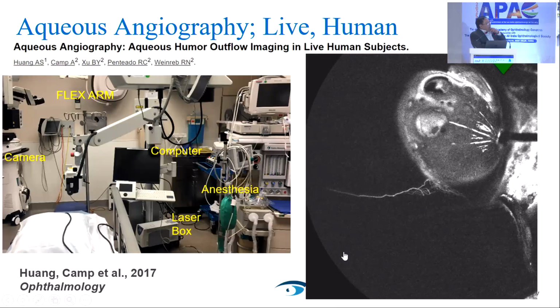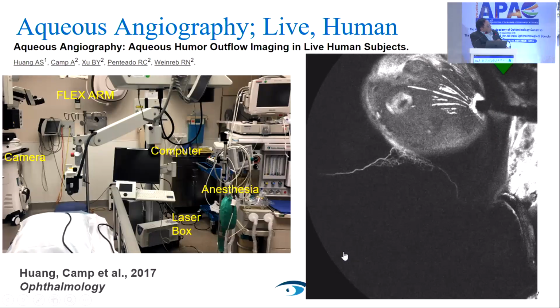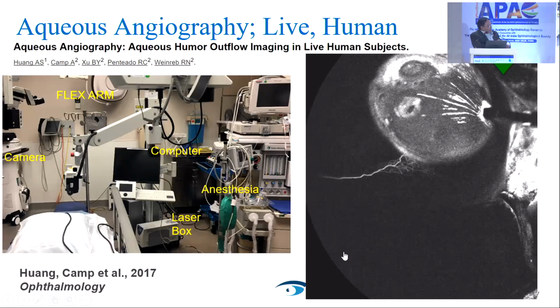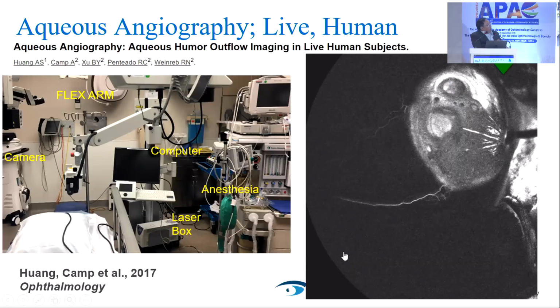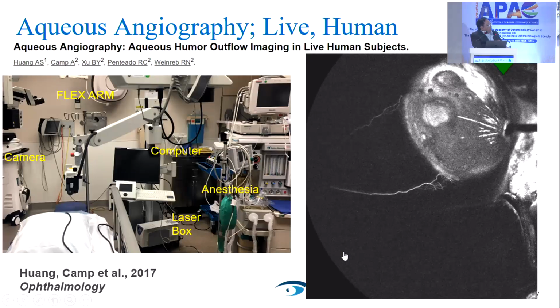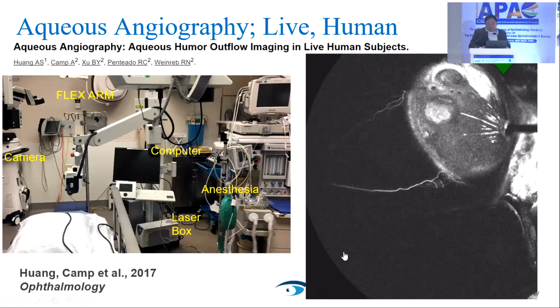Now, because this is cataract surgery, we can ask her, I want you to look up. So she will look up, and then you'll see this area very bright, and then it's starting to go away. So again, it's dynamic. Then she's going to reset her eye, and superior nasal, there's going to be another region where there's pulsatile outflow. So the outflow is pulsatile, it's segmental, and it's dynamic because the region down here is actually starting to grow back.